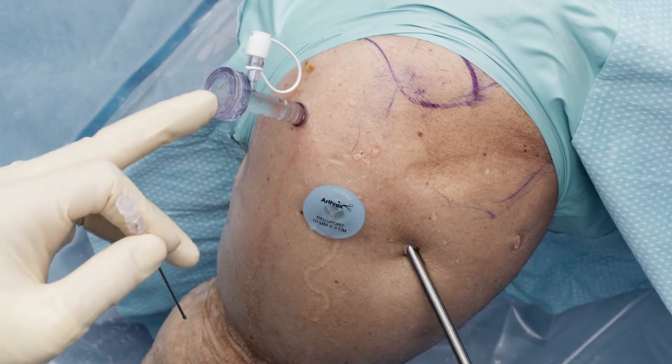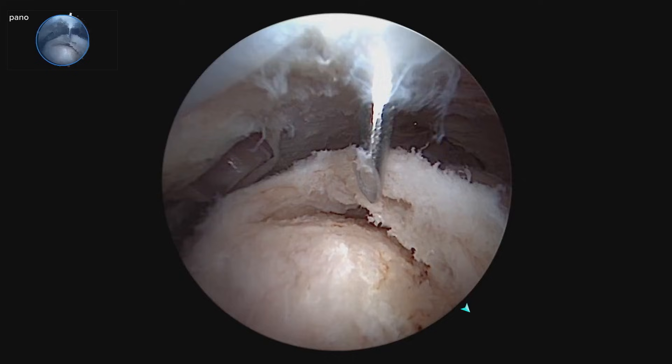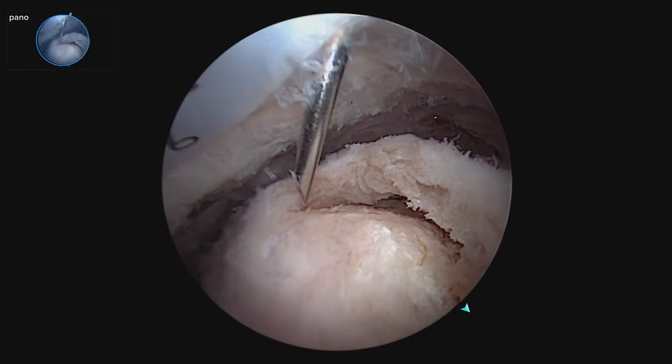Here we've added an ASL portal for suture management. I would like to put both anchors — one anchor here and one anchor here.